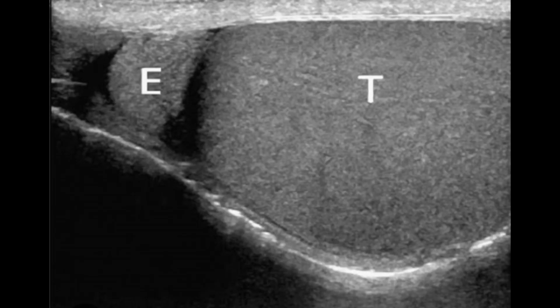This is what the normal practice should be. You have a single image for each single testis. Here a T is noted for the testicle, and you can appreciate that the parenchyma is homogeneous, there is no irregularity, and no intraparenchymal lesion visible in it. Besides this, you have the epididymis in view as well. The epididymis is visible and the normal testis is visible with a very smooth outline and no pathology. So you can see a single testis in a single image along with the epididymis, so that you can compare the echogenicity of both at the same time.